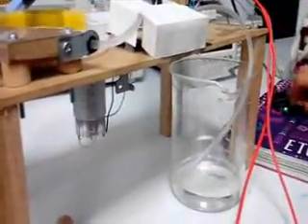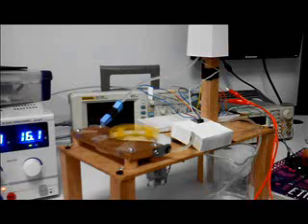In this one, we can see the rollers boost the water with the motor. The mechanism works with the rollers boosting the solution at different speeds. This causes the beginning of the microdrip, so if the speed increases, the microdrip does too, and that is the reason why the flow increases proportionally with the PWM.